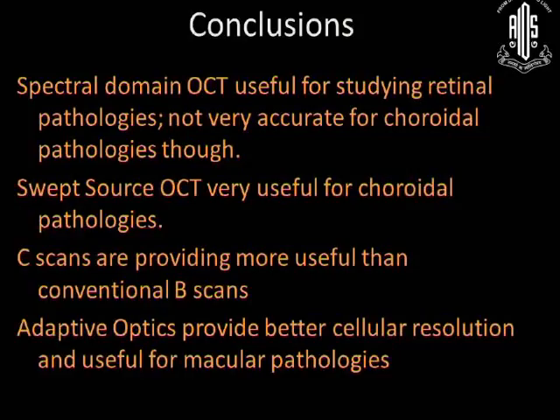And adaptive optics provide better cellular resolution, but probably I would not say that adaptive optics has reached a stage where we need it in our clinical practice. Honestly, it feels good to look at the rods and the cones, but you can do it otherwise also by autofluorescence or by other imaging modalities.